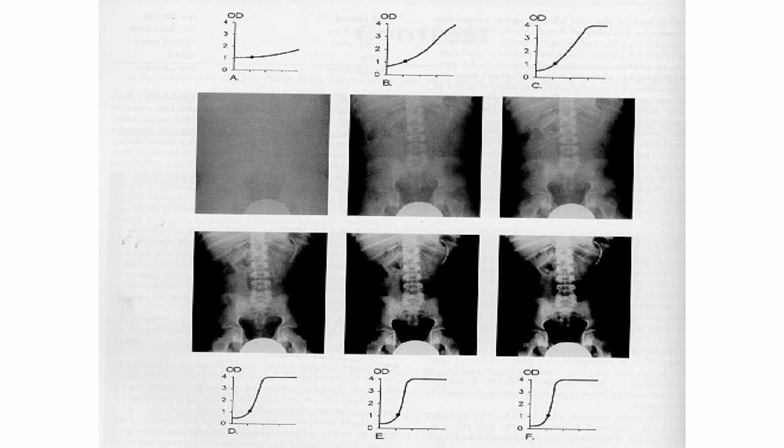Dito, pinapakita yung optical density, at the same time yung contrast. Diba? From A to letter F. Sa letter A na image, may contrast o wala? May nakikita kayong contrast?